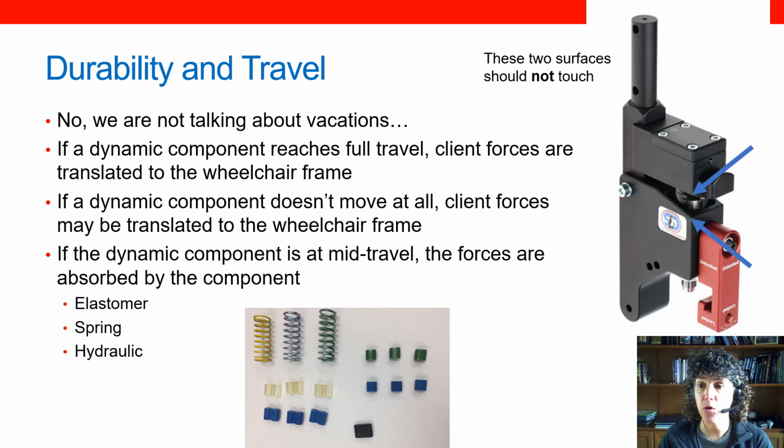If the dynamic component doesn't move at all, perhaps the resistance is too high, we may have a similar result. But if that dynamic component is allowed to hang out kind of mid-travel, then the dynamic component can do its job. It can absorb forces, and that will either be an elastomer, a spring, or a hydraulic.